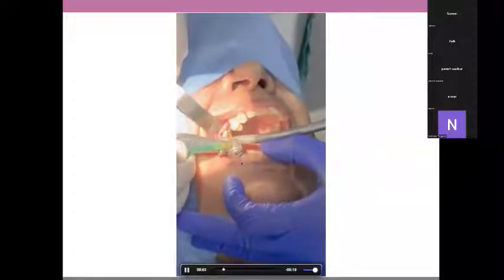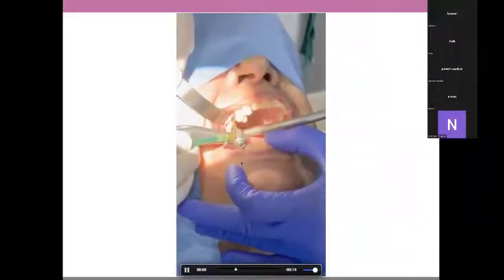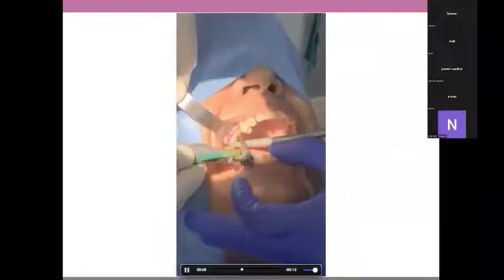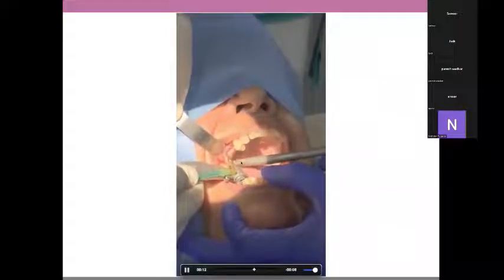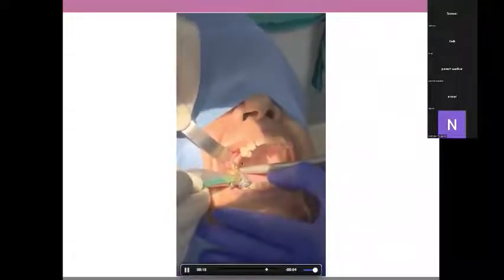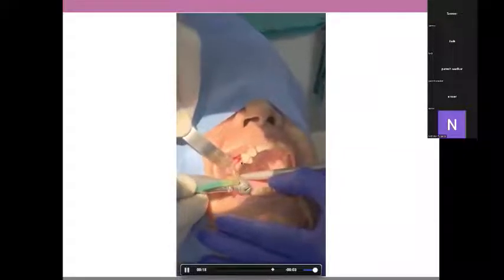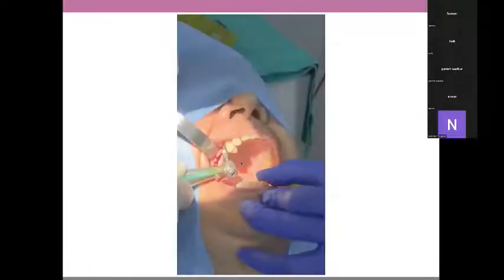Now I'm expanding my bone using special drills, because this was a plan. Then I only wanted my implant location, and the rest I am doing freehand. Now, if you see on the second osteotomy, I will not go full depth. I am just going and controlling my depth because I'm very close to the sinus floor. That information I get by the tactile sensation.